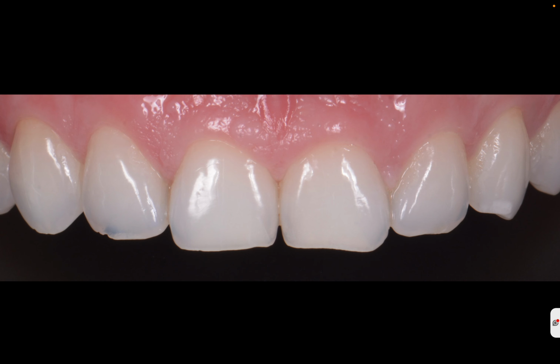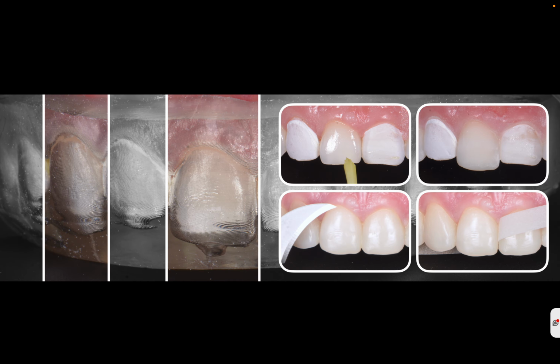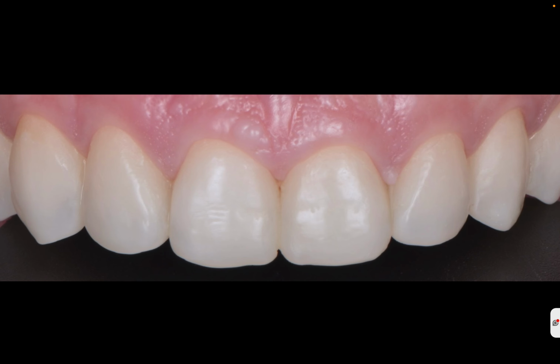As I comment, for example, this patient presents to the clinic because she has a little bit of tooth wear in the incisors, and with just one silicone guide, which we are going to explain how to select and how to do properly, just with one shade and one material we can recover this anatomy in a fast and predictable way. That's the main goal, no?